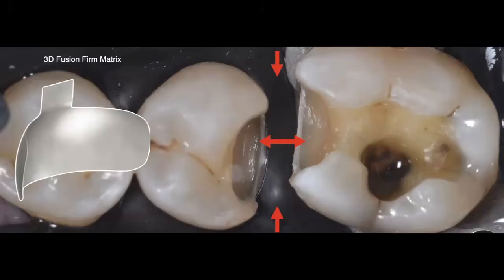So for a case like this, where I can see that my proximal boxes are wide and deep, and there's two of them, one right next to the other and one facing the other, my selection is always going to tend to be the 3D Fusion firm matrix band. Now, these firm bands are thicker than the 3D Fusion bands that are color coded and that have Teflon inside. These firm bands are stiffer.